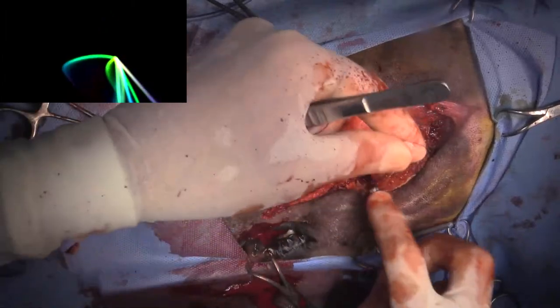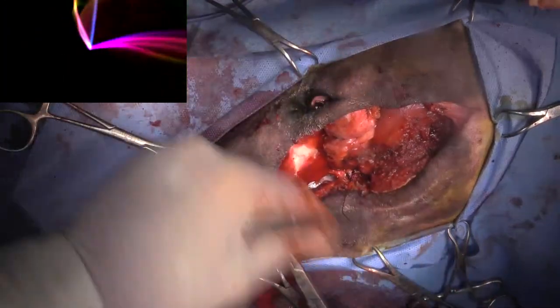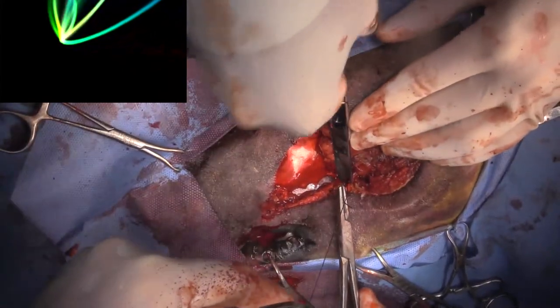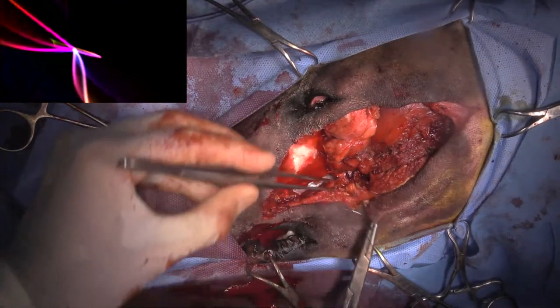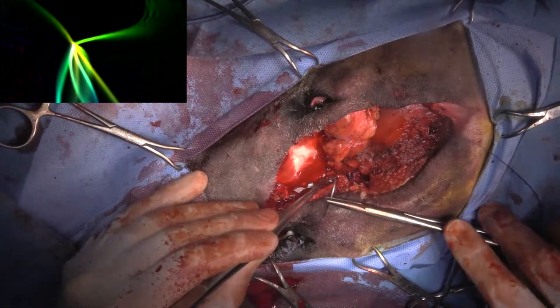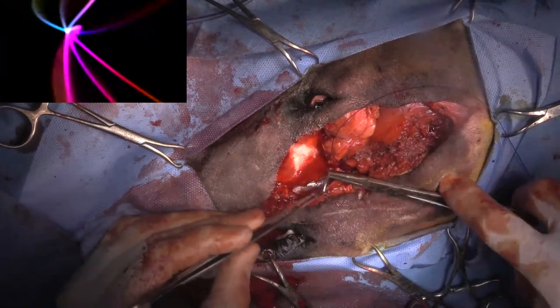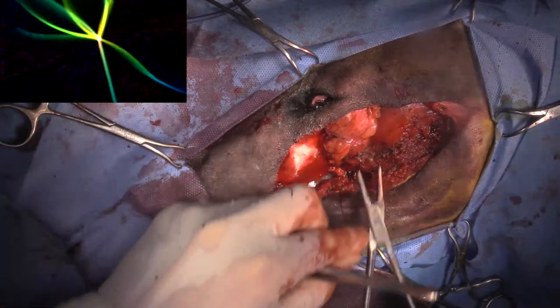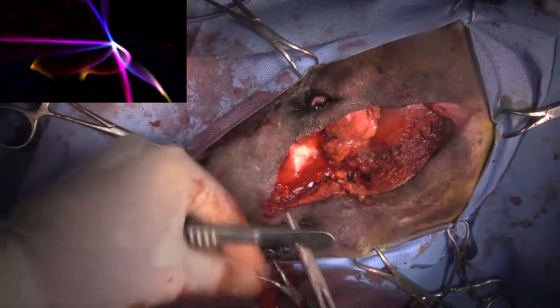Question about how many of these have you performed previously? Of this exact surgery, probably about 30, something like that. It's quite a common one. Now, I've done caudal maxillectomies and a lot more, but the combined orbitectomy caudal maxillectomy would be about that number. Actually, coming from this direction may be easier. And this would be up there on the degree of difficulty as far as maxillofacial surgery is concerned.